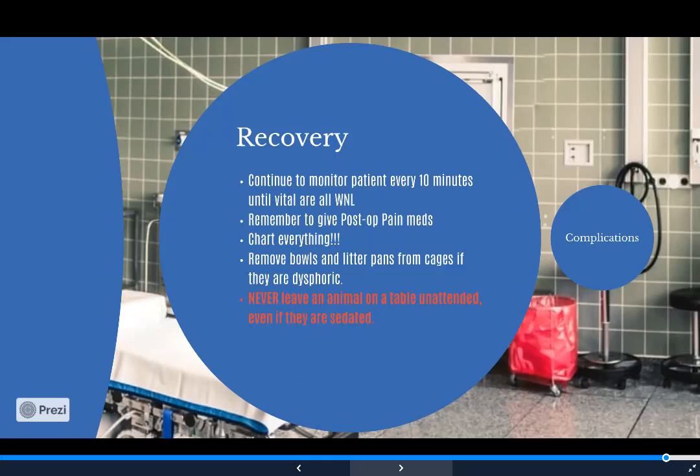So continue to monitor a patient every 10 minutes until the vitals are pretty normal. You don't have to temp them every 10 minutes, but monitor them pretty well. Then remember to give the post-op pain meds, chart everything that you're doing, and remove the bowls and litter pans out of the cage because they're going to be dysphoric. And again, don't leave an animal unattended on a table ever because you just never know.